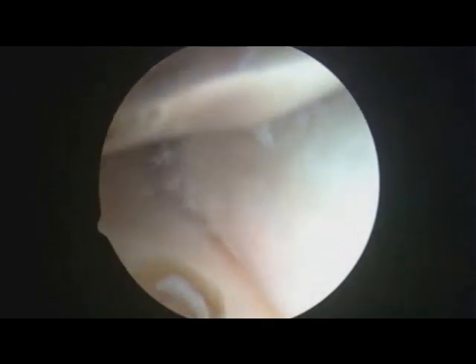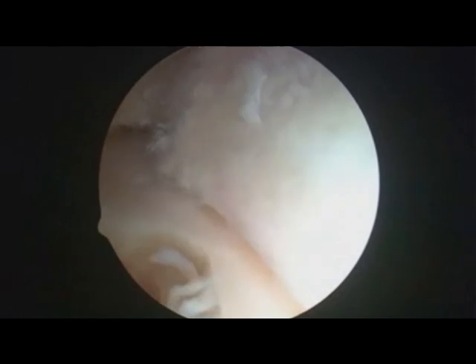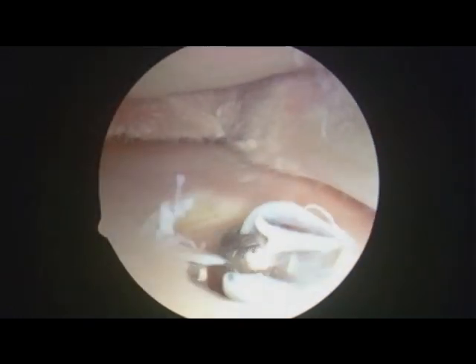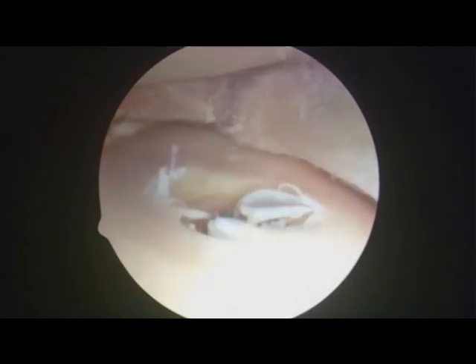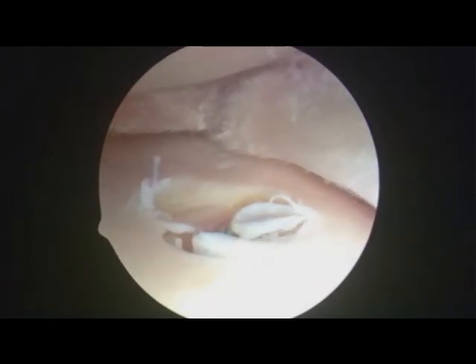So if you look inside here, I'm going to show that the implant that goes up, this device needs to sit right at the level that you want your implant to sit. So it's not above the joint. You want to sit just at, or if anything, just a little bit below the joint surface, because you can always make this up with the cementing.